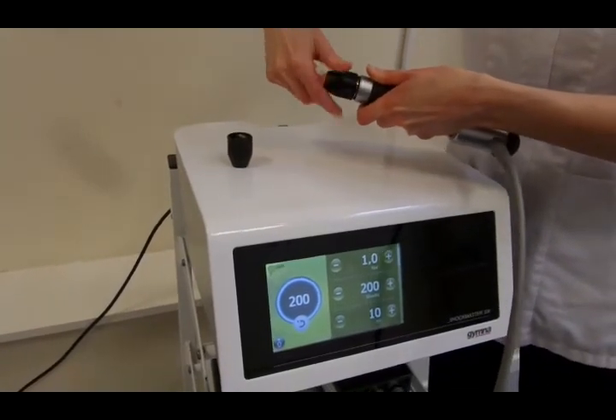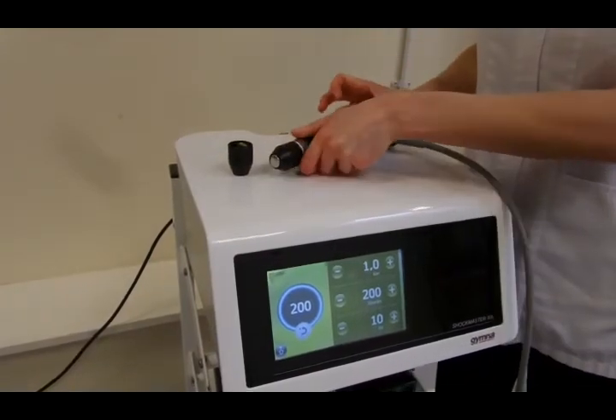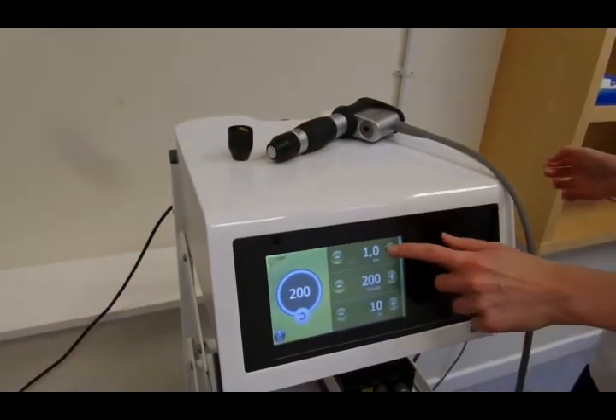We'll change the head here to the 15mm convex head rather than the concave head. The convex head is the silver head; the concave head is the copper coloured head.